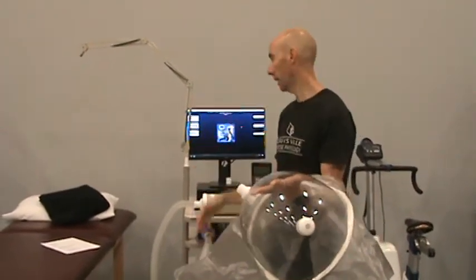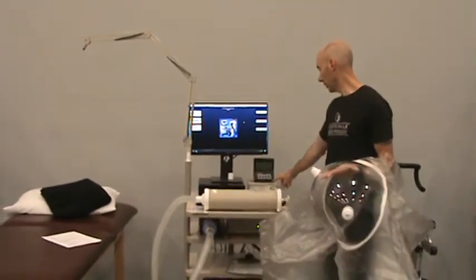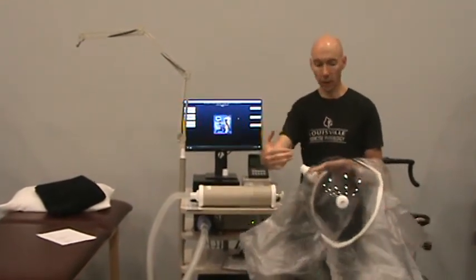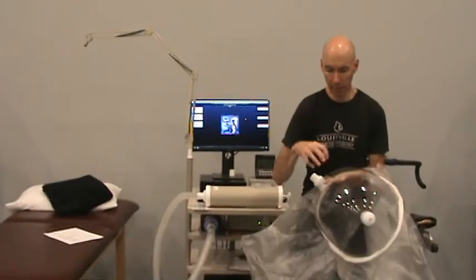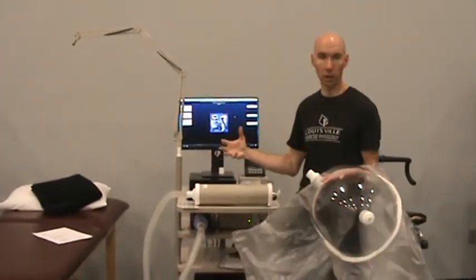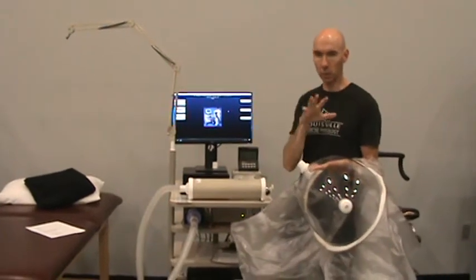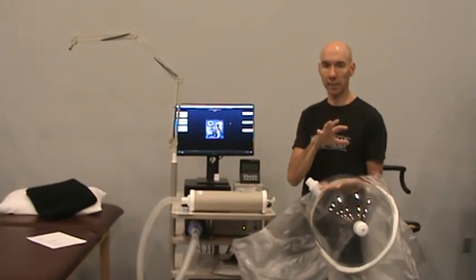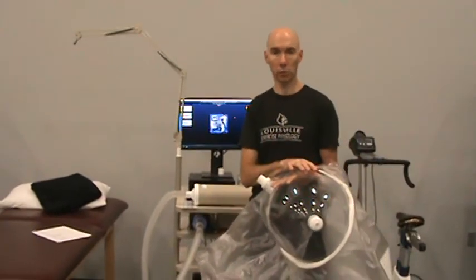Once we get our subject in place, we're then going to turn back on this thing known as the dilution pump. That's going to create some suction to make sure we're pulling air into the bubble and then pulling it out of the bubble as he's expiring into the cart for analysis. Okay, so we'll run through this setup of the gas collection hood momentarily. We're going to take a quick pause, get our subject in position. We'll be right back.